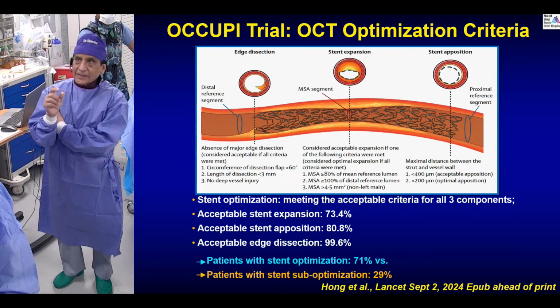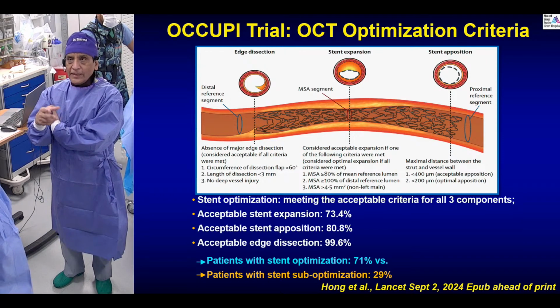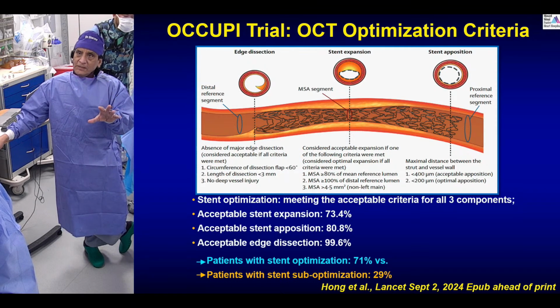Why am I putting in a little extra time? Maybe knowing that Kiski is quite involved and we are trying to do more OCT. How do you comment on these criteria? Are they a little unusual or very tough to achieve? What do you think, Kiski?